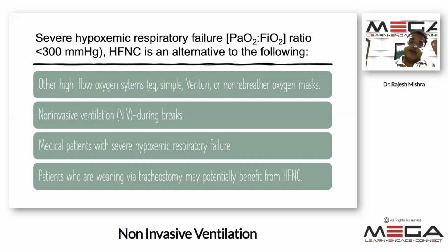Apart from that, even HFNC is entering your OT. HFNC is being used extensively when there is a crisis, even in the ward to take care of mild patients. Even in the post-op period, it helps us when you have extubated the patient and you want to buy some time for 4, 6, 8 hours while the patient is getting better. It is also being used during the peri-intubation period, where you need to oxygenate the patient properly till you have other gadgets available for oxygenation. So HFNC is finding its place in ICU, in OT, even in emergency, and it is being placed properly.